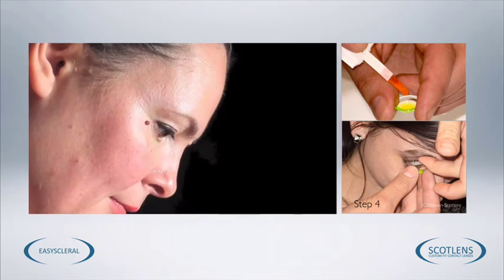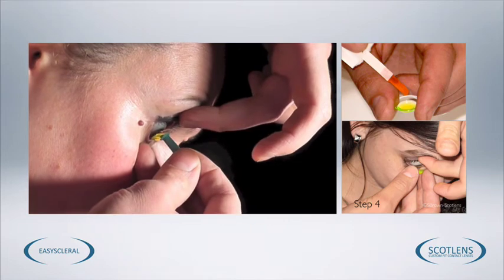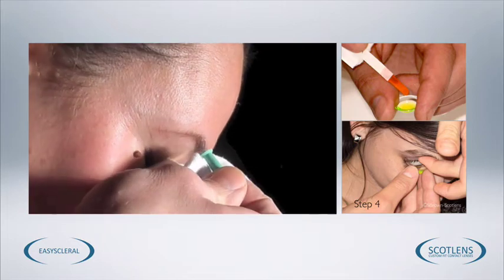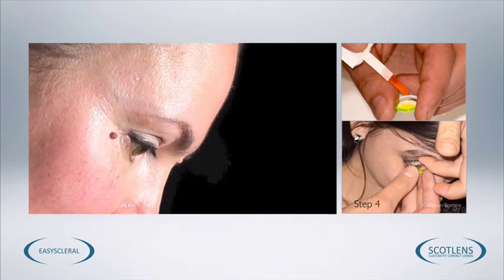To place the lens on the eye, just get your patient to look down about 45 degrees, hold the lids out of the way, place the lens into the lower sulcus and straight onto the eye, covering the cornea, and then just mop up any excess saline with some tissue paper.